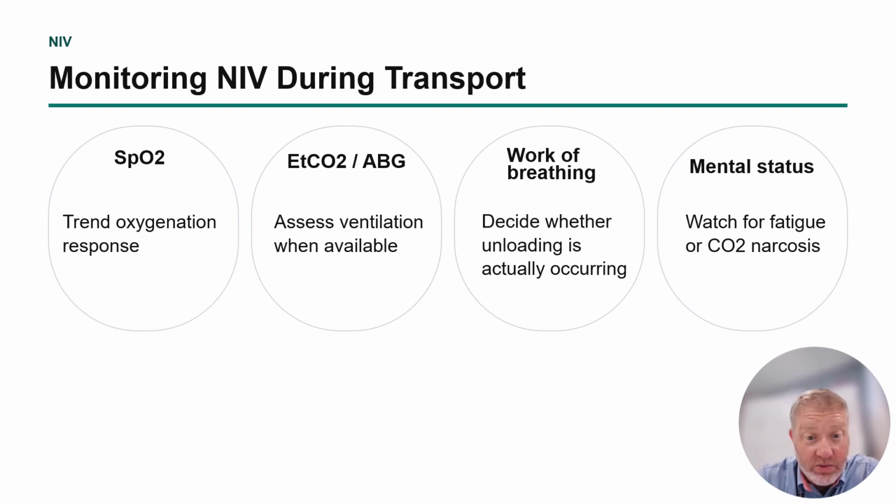The end-tidal CO2 and ABG, and that will be for another lecture. That's way too much for this one. Work of breathing, of course, just patient assessment. Look, listen, and feel to decide whether or not it's actually helping, and then their mental status change. Watch for any kind of fatigue or CO2 narcosis, which would be, I mean, they would pretty much become obtunded at that point.